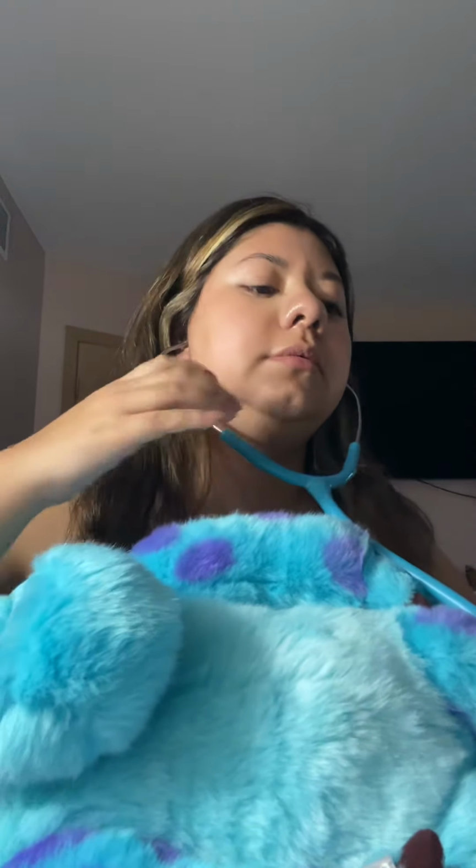Next, we would have the patient lie down onto the left side. Here's my patient, left side, and we would listen at the mid-clavicular line down.